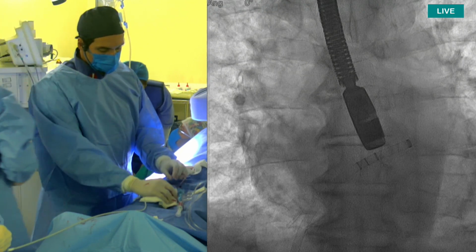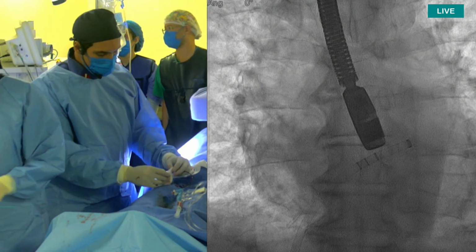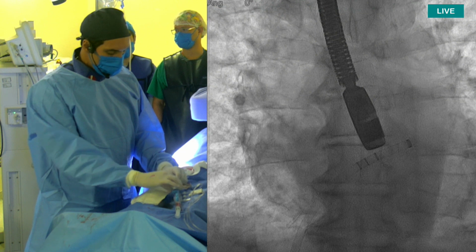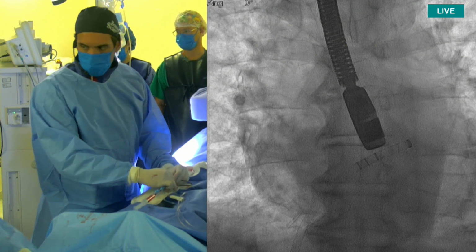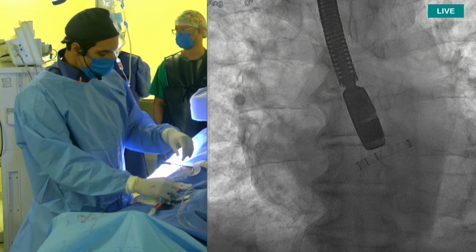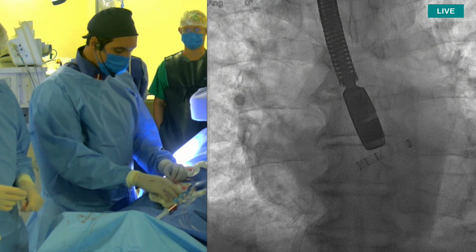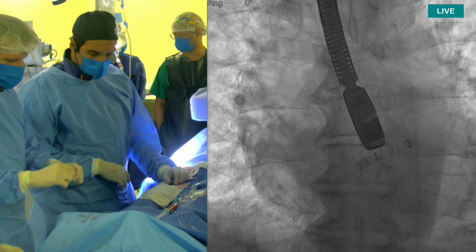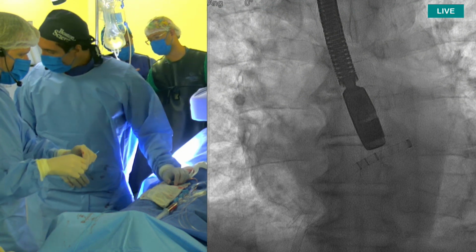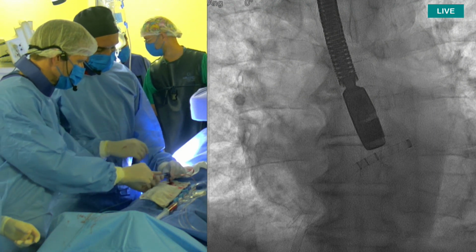Actually, I do the full dose before the transseptal puncture because we guide by echo and then it's very safe. And now we transition to ICE, and then you need to do the full dose before the puncture. I think there are different strategies according to experience, but there's no concern about doing the full dose before the transseptal puncture at all. No, I mean, this is a controlled procedure and transseptal puncture under TE guidance. So, there's no risk in giving a full dose of heparin beforehand, I would say.